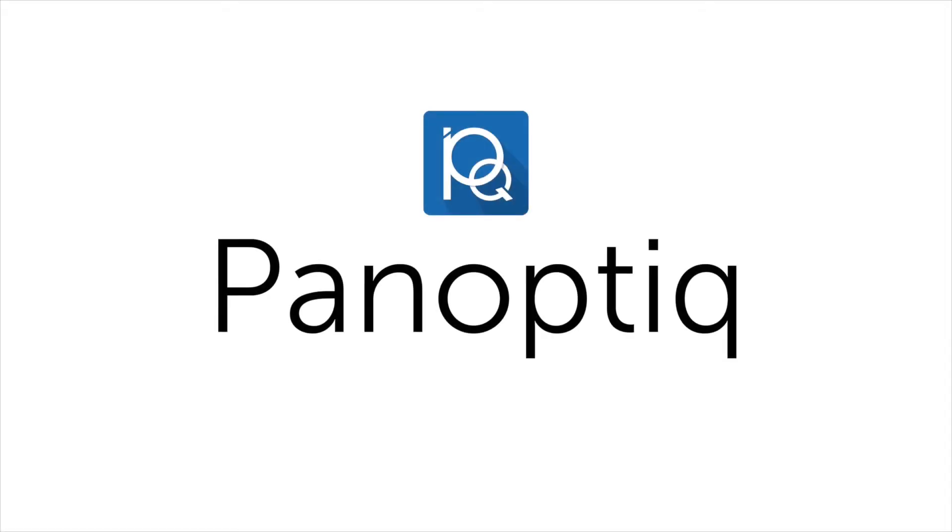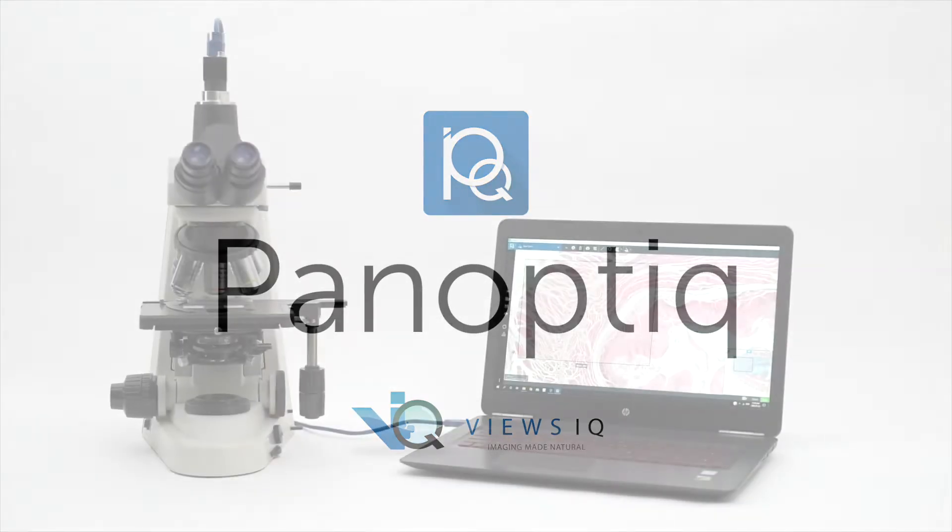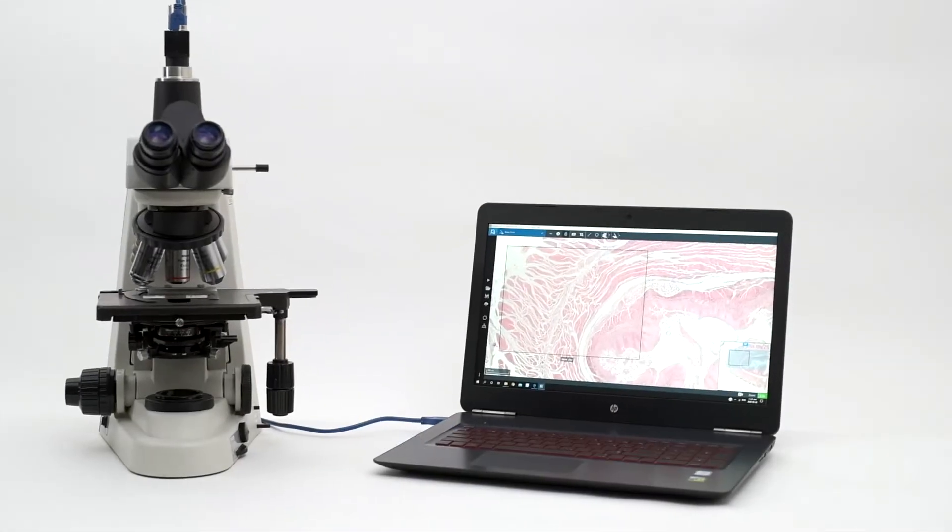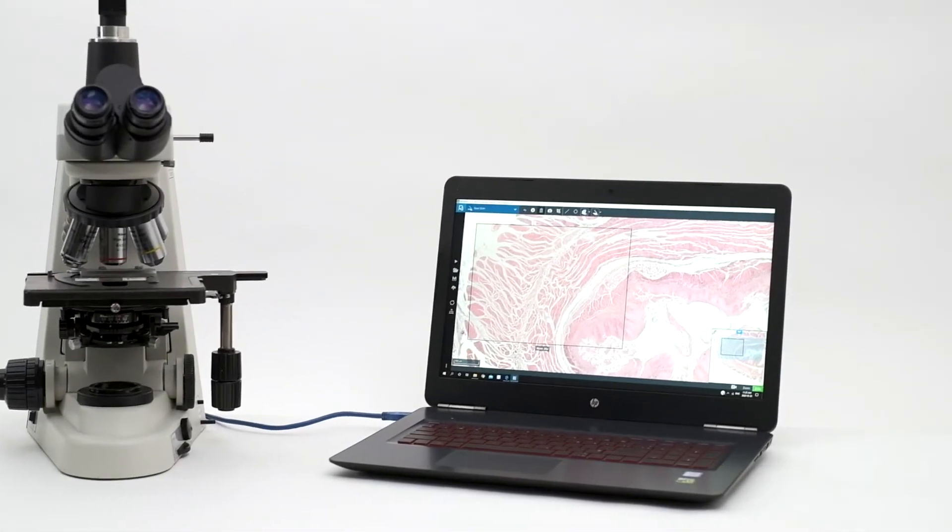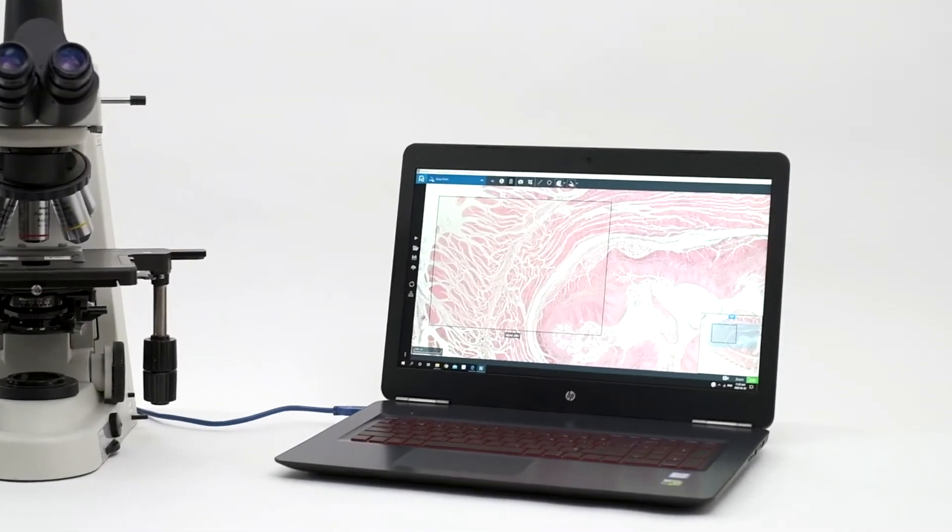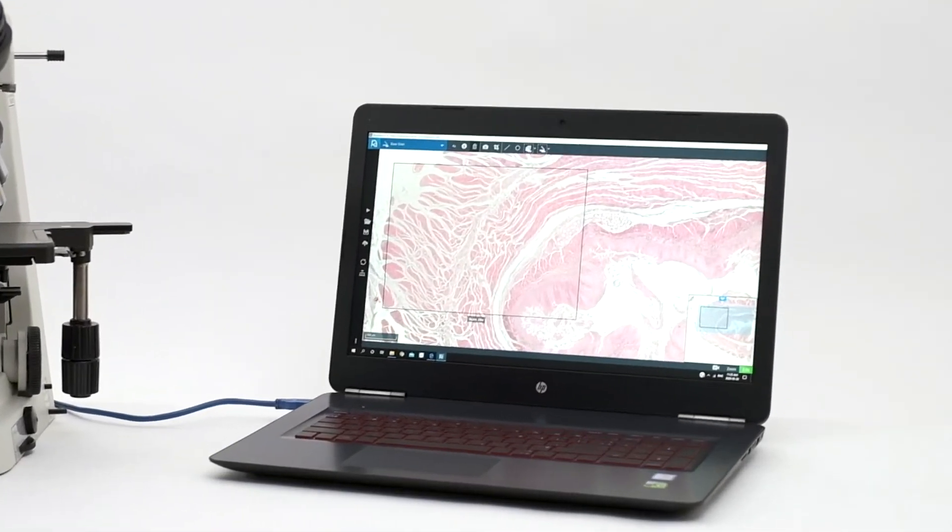Hello and welcome to Panoptic by Views IQ. Panoptic is a software-based approach to digitizing pathology samples.